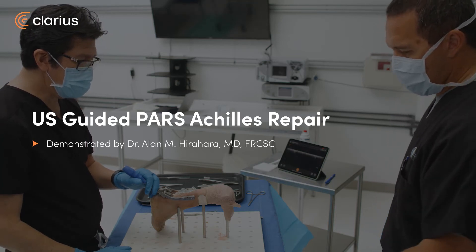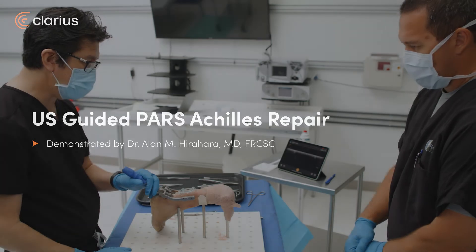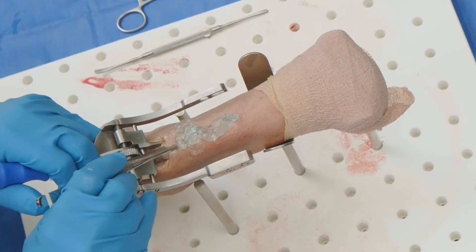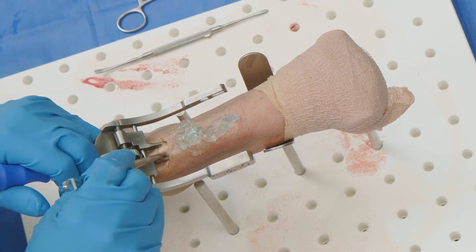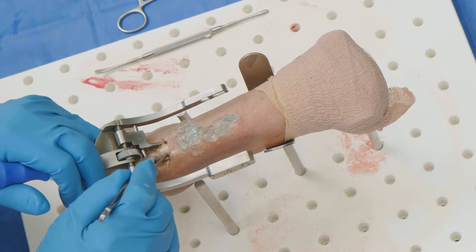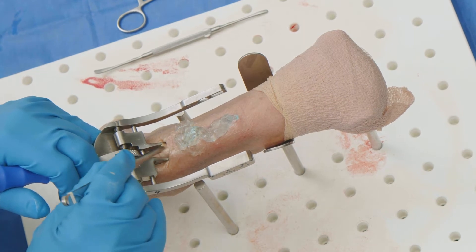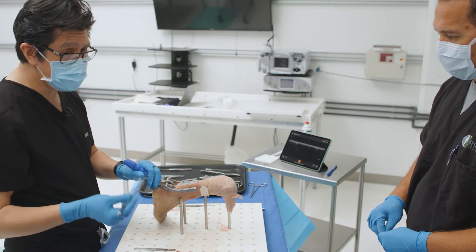We're going to demonstrate today a PARS Achilles technique of repair of an Achilles rupture. We're using a cadaver. I've opened up the region and the peritenon to be able to see. I did not cut the Achilles, as there's really no need — it'll help maintain traction on this cadaver. The whole purpose of this is to demonstrate that the ideal way to do this technique is actually using ultrasound.